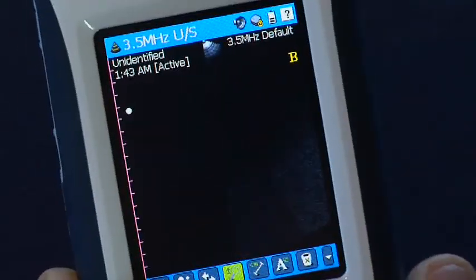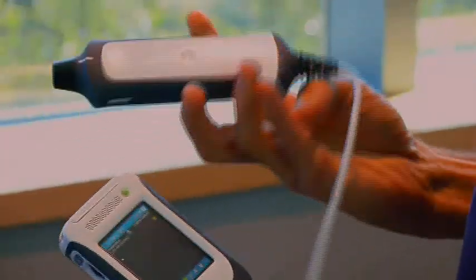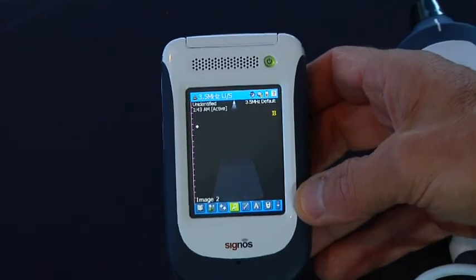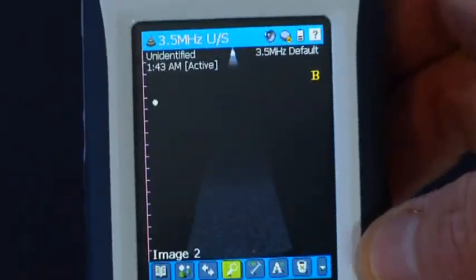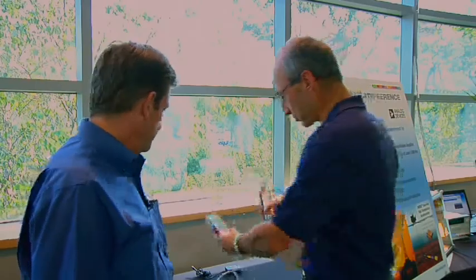And by moving this here and the gyro determining the location of the probe, it can recreate the signal here. So instead of using fairly expensive, power-hungry transducers in the probe, they can use much lower cost, fewer transducers to actually capture the image. In addition, this is using power management products. It's using high-speed analog to digital converters because the transducer itself operates at a very high frequency.